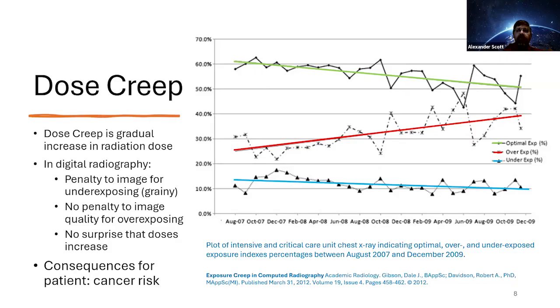And you could ask, well, what's so bad about that? And the answer is cancer risk. I usually tell patients that the riskiest part of their x-ray is making left-hand turns driving to the hospital. And it's at least in Los Angeles. I'm pretty sure that's true.